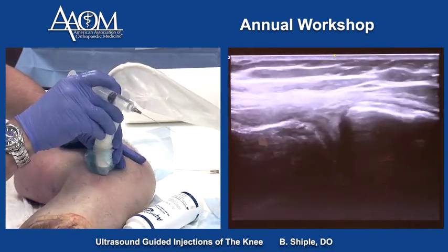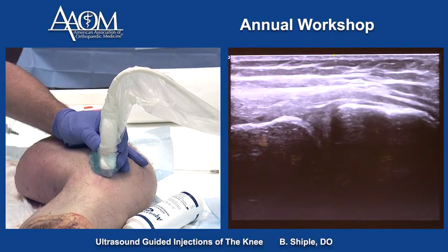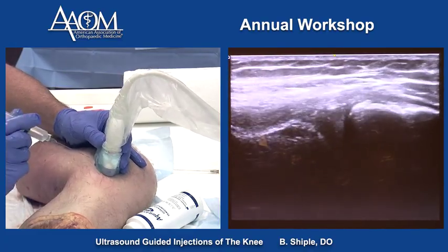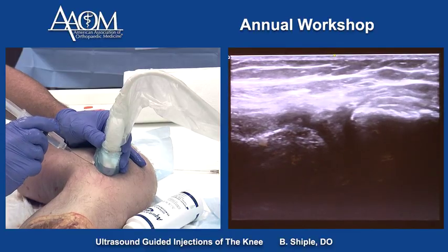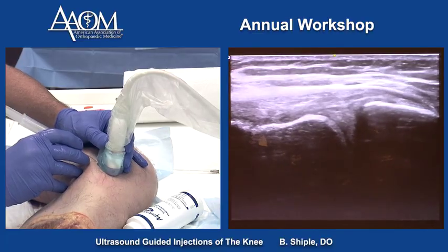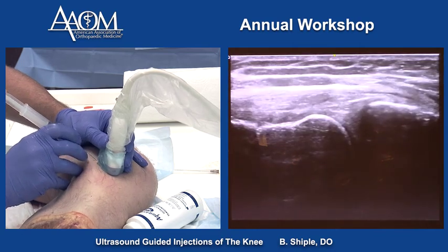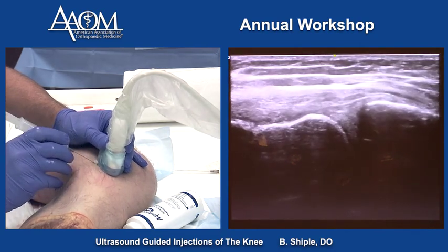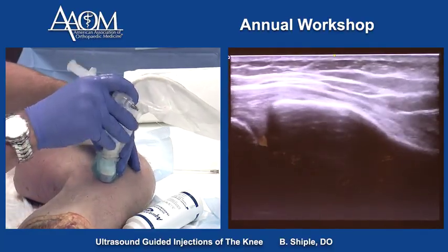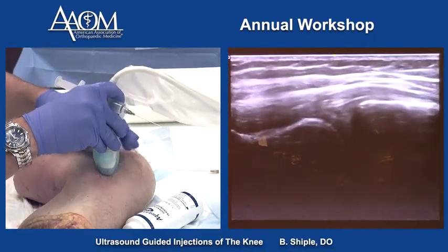To inject the medial meniscus in short axis, put the coronary ligament and medial meniscus over the center of the screen as our target, and enter about a centimeter away from the probe. The needle is in the MCL-medial meniscus interface right there. This is a very healthy medial meniscus — it's kind of hard rubber to pass the needle through, unlike a patient's beat-up medial meniscus, which is like injecting a sponge.